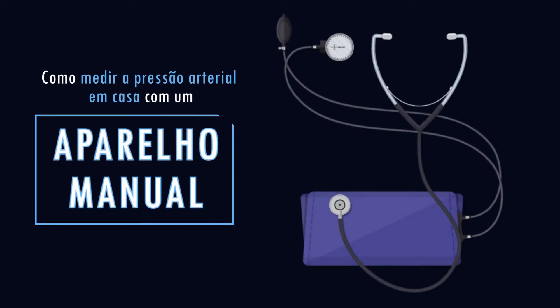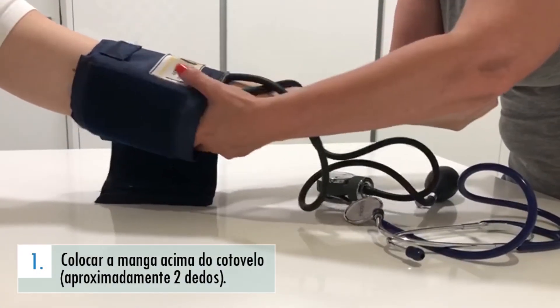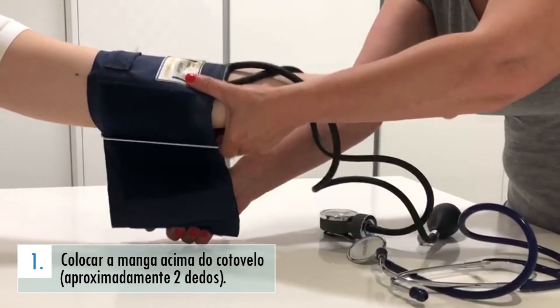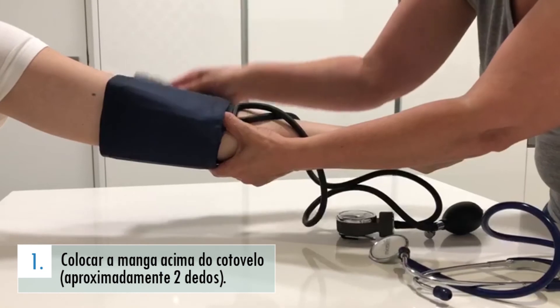Como deve medir a pressão arterial com o aparelho manual? Deve colocar a braçadeira acima do cotovelo, aproximadamente dois dedos, tal como procederia com o aparelho digital, e manter-se sentado, com as pernas descruzadas e sossegado.